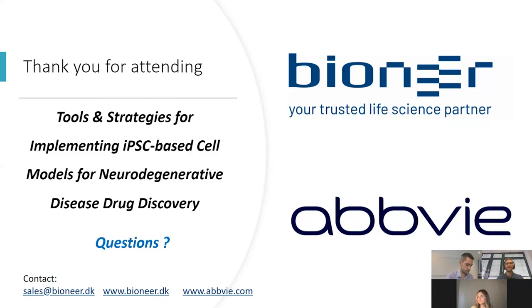And one of the reasons, and this is just one example I want to close this reply with, is that if you use these classical neuronal supplements like B27 or B27+, these will normally come with a lot of corticosteroids. And this is something that microglia clearly will not like. It is in there because it was developed originally for primary cultures. Do they de-differentiate? No, we have not seen it over at least the time that we observed this, which is at least plenty of weeks.